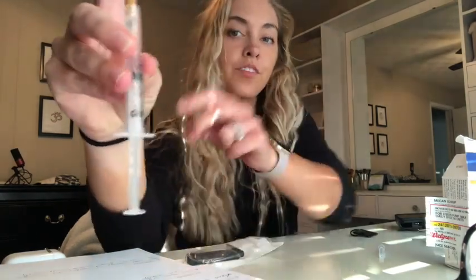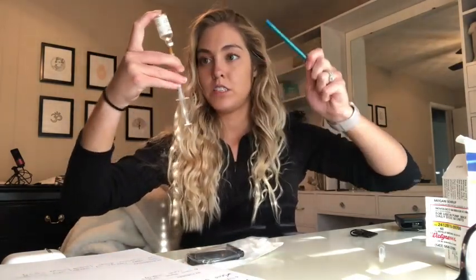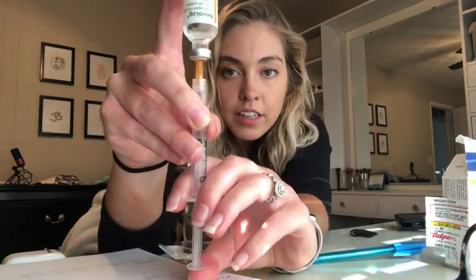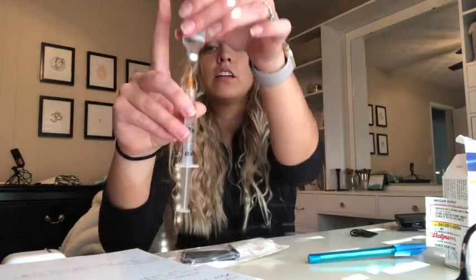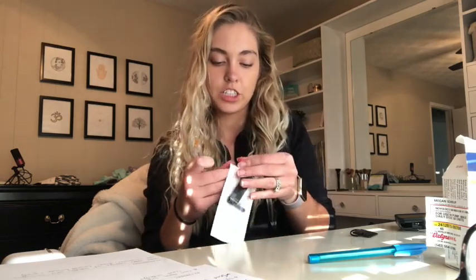Okay, so I've got quite a few bubbles. So I just take a pen and kind of tap to break the bubbles up and send them to the top. And then I just press them back up into the vial and pull back down until I have the right amount of insulin that I need. And then just take that off. Open up the cartridge.